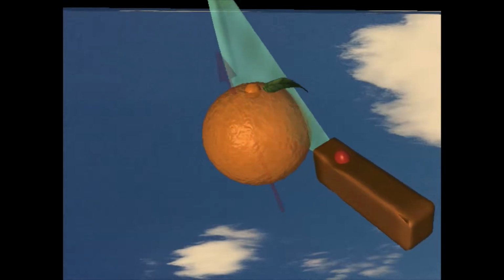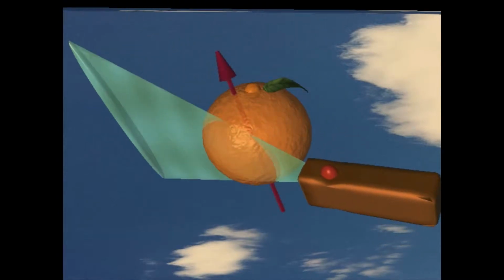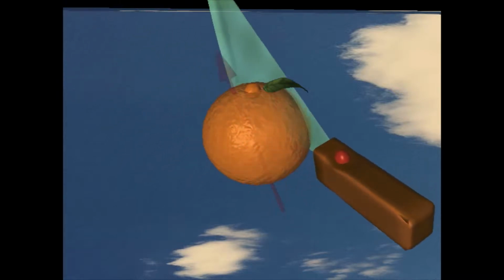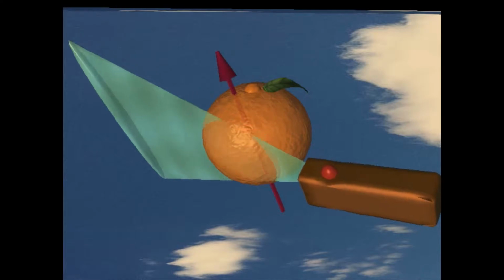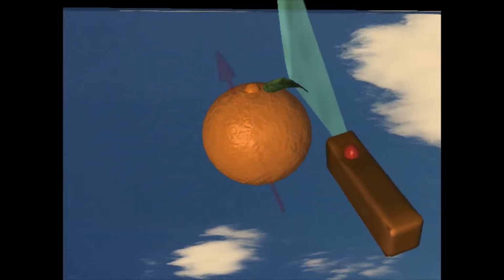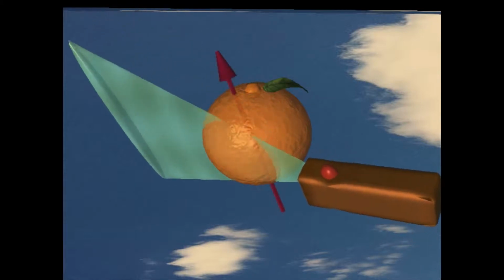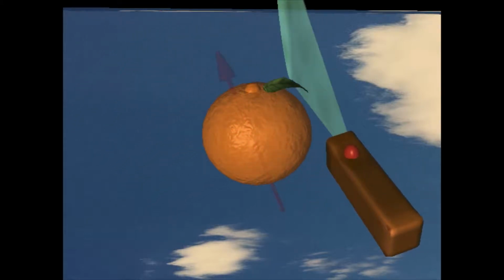If you're not familiar with doing echo, it's really just like any other type of ultrasound. You have to remember that the two-dimensional beam is just a little wafer-thin sliver, and unless you pass it through the object and point at the object, you won't see the object. You can be right next to it. If you don't have the beam across it, you will not see it.